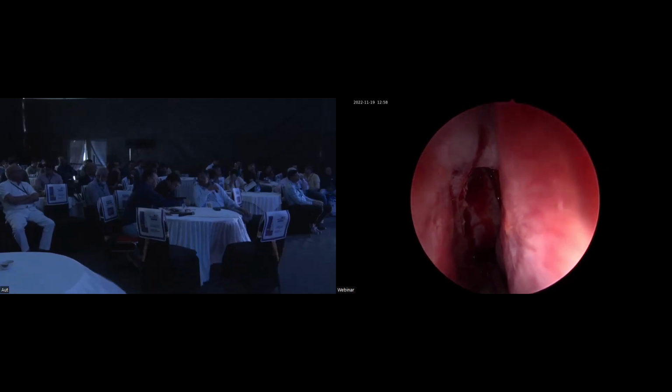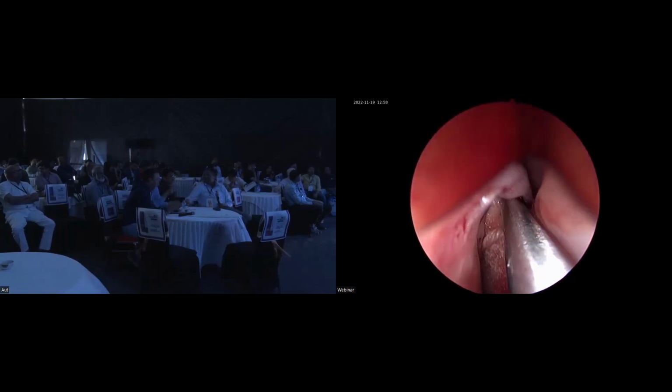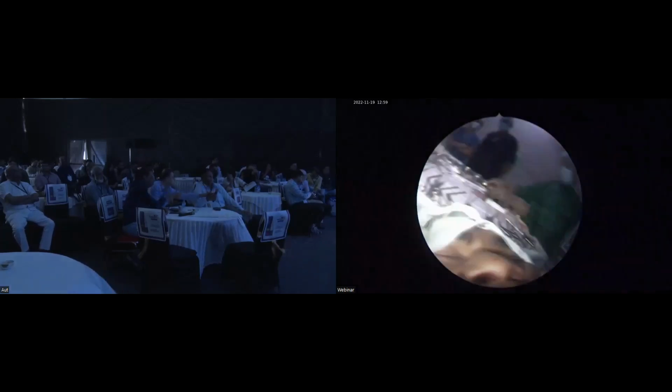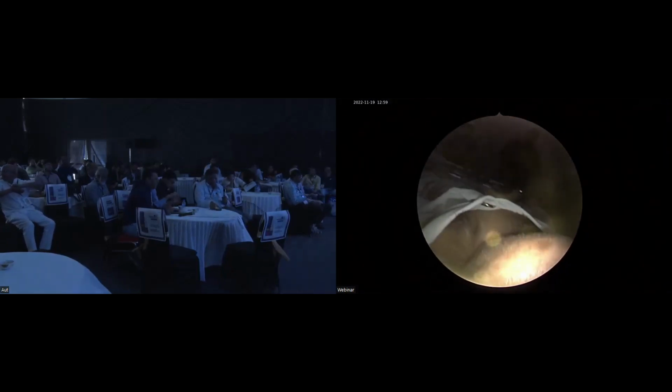I don't know. How it is. I don't know. So... I'll just switch to 70-degree and curved suction to show you the frontal by using the intact bulla technique. As there is not much disease in the bulla, we can do that. Yes. Here the landmarks are preserved because of the limited disease.